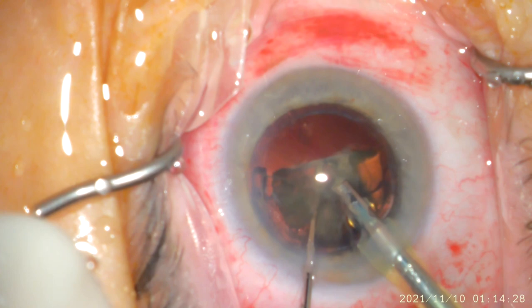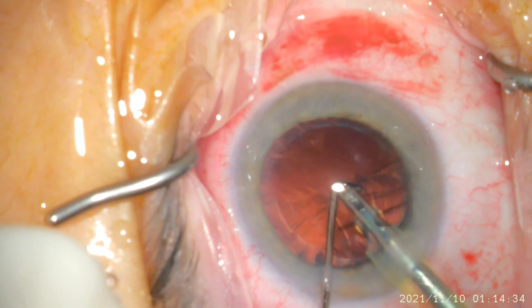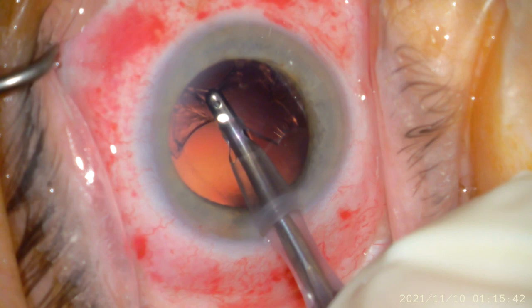The ultrasonic energy with the FACO handpiece takes care of the mature cataract, or the natural lens, and the whole process in this step takes only a few seconds.